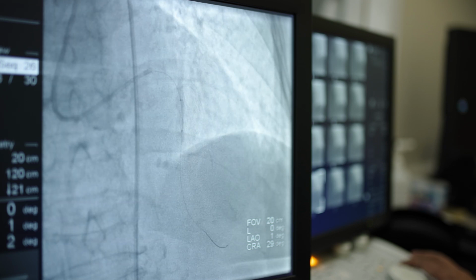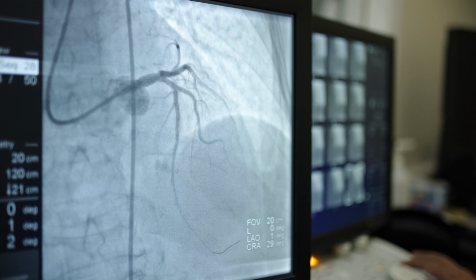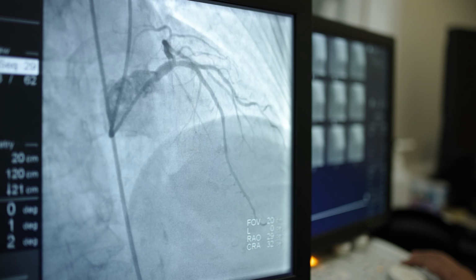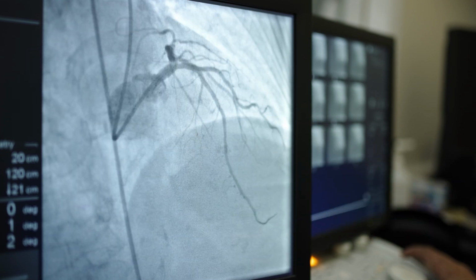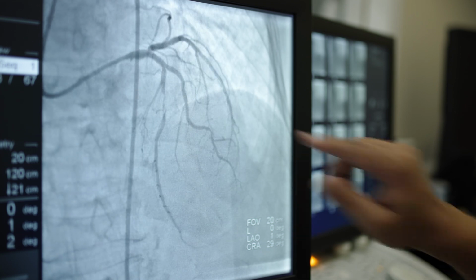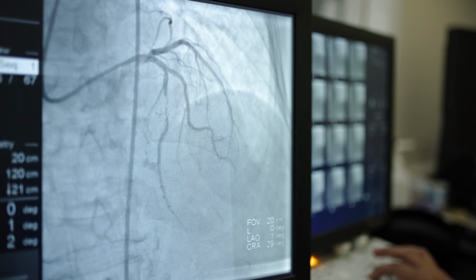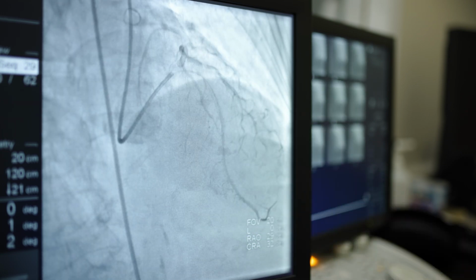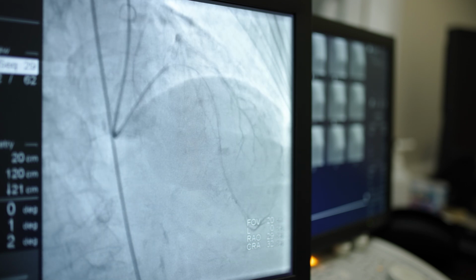This is what's called post dilatation, just to make sure that the stent in the vessel is fully dilated and open. And this is from another view here. This is the 99%, as you can see here. This is what it was before, and that is now.